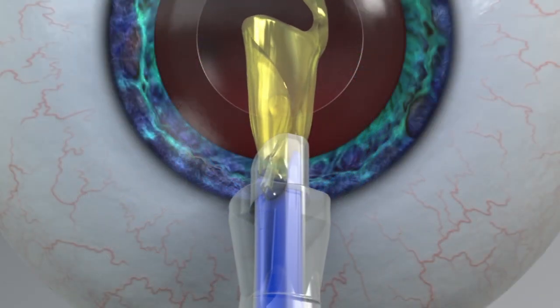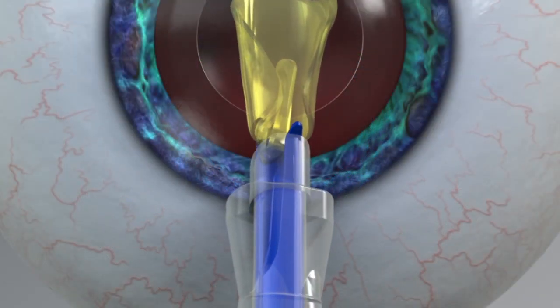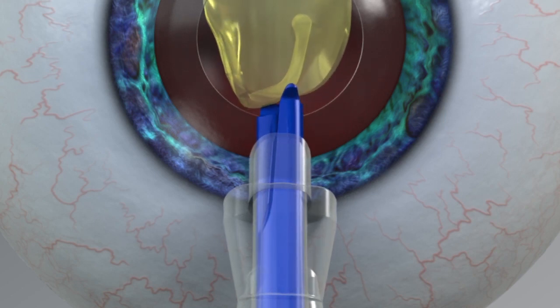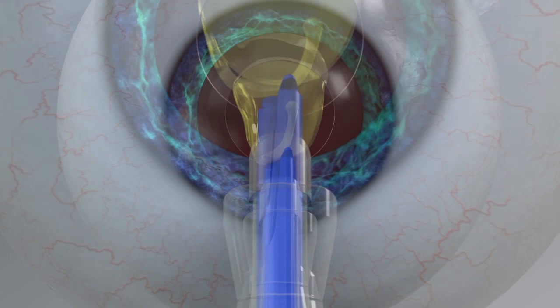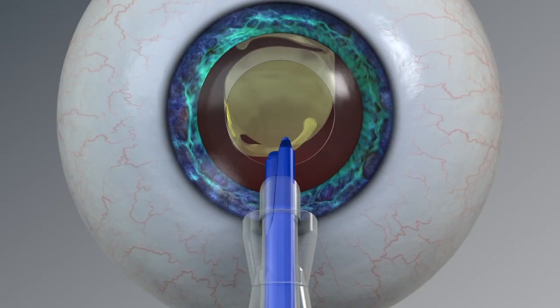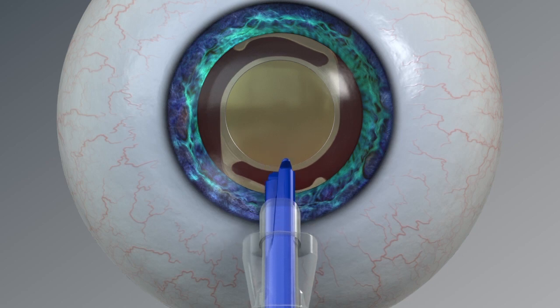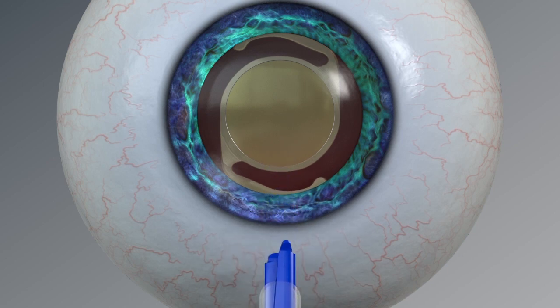As the optic exits, rotate the device back counterclockwise to a slightly bevel-right orientation, or until the nozzle opening faces slightly right. This orientation ensures that the optic unfolds anterior side up within the capsular bag. The plunger should be advanced until the optic and haptic are clear of the nozzle opening.